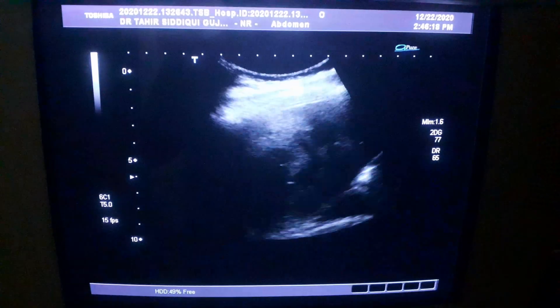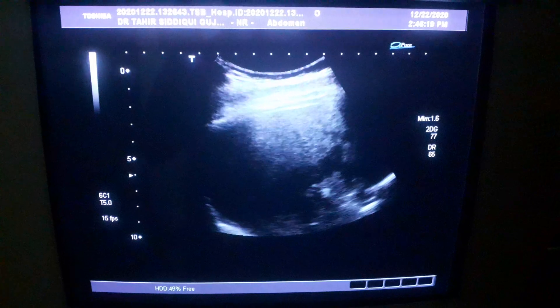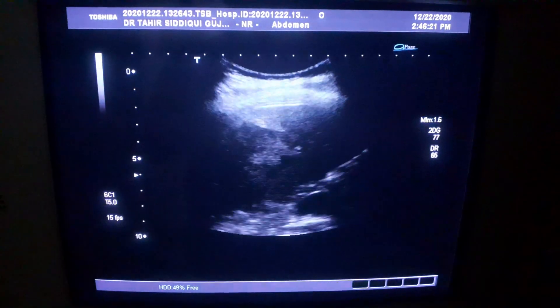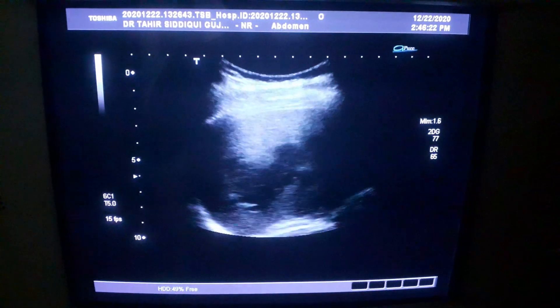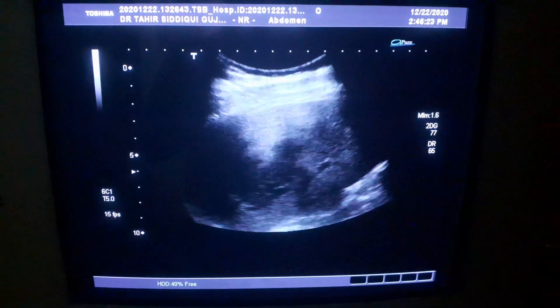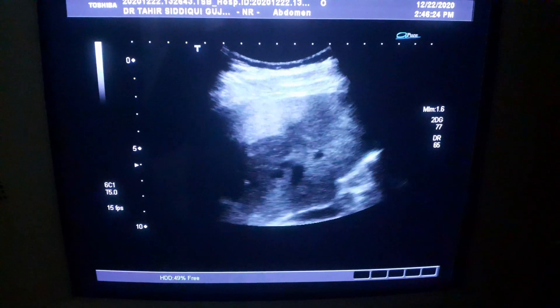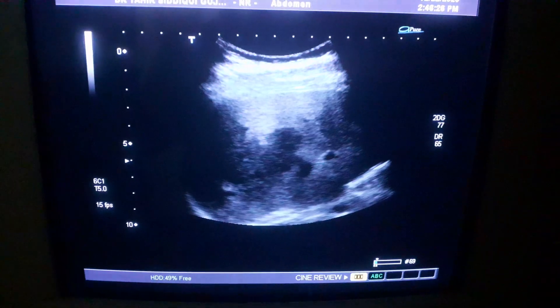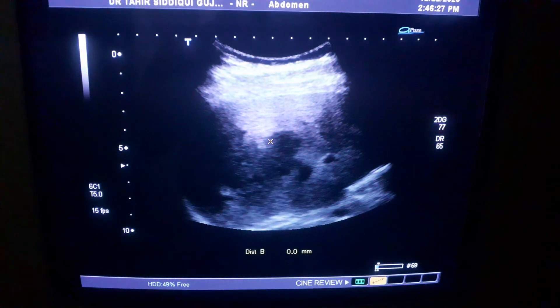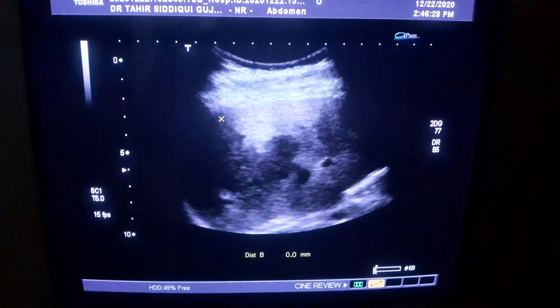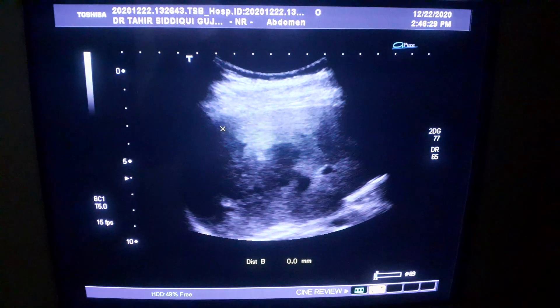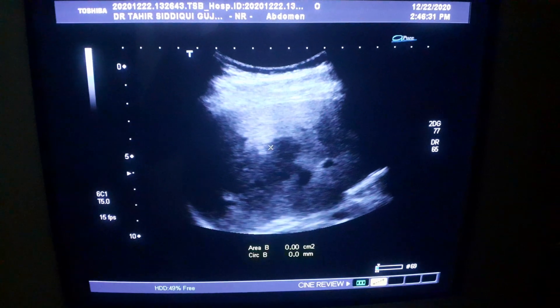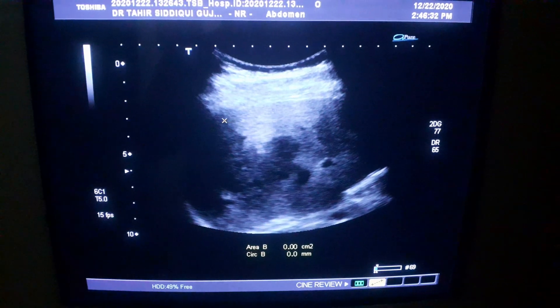Now within this fatty liver you can see multiple map-shaped areas that are hypoechoic and irregularly outlined. You can see this margin here.